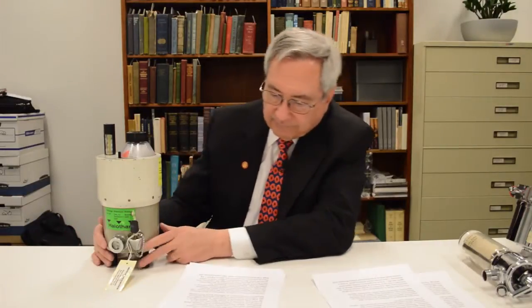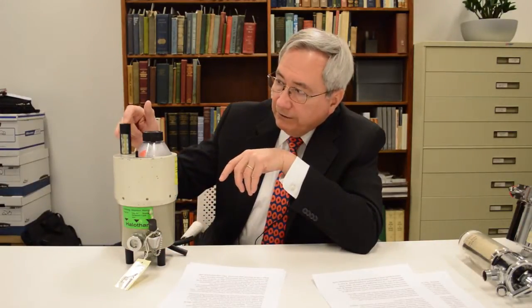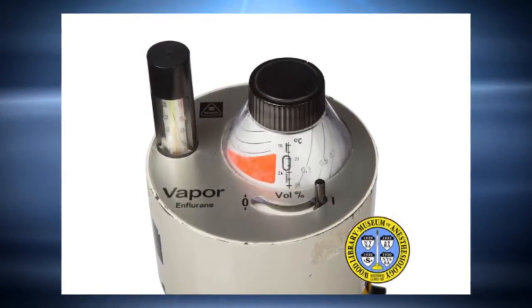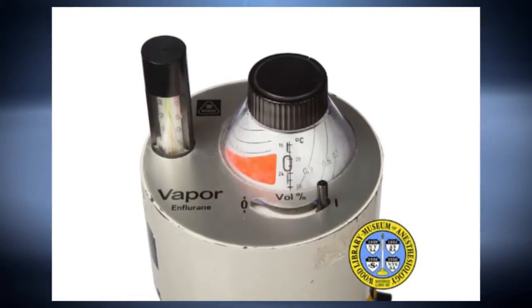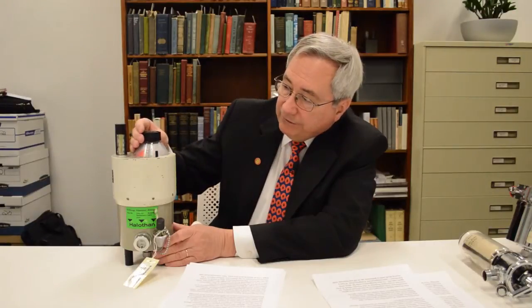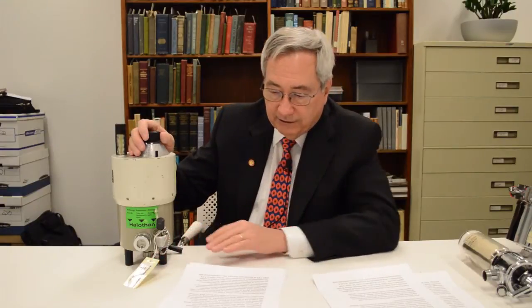Now this one has on the top of it a thermometer that dips down into the vaporizer into a pool of the liquid anesthetic. So you can measure by looking at this and determine what that temperature is. On the top is an on-off switch. So again, you've got a definitive mechanism so that you can look at a glance and see that there is no agent coming out or perhaps some agent coming out. Once that lever is engaged, then you can rotate the dial to begin to deliver anesthetic agent into the system and to the patient.